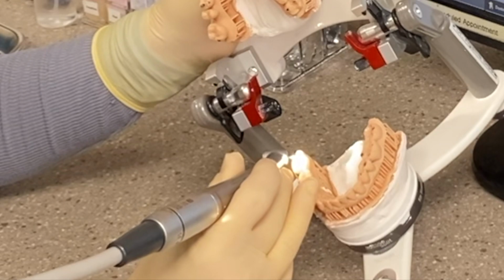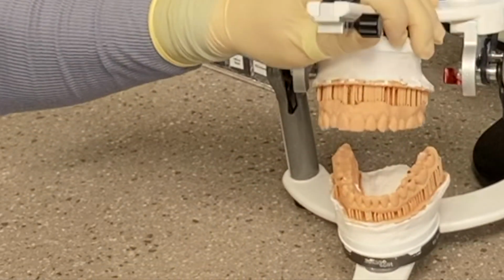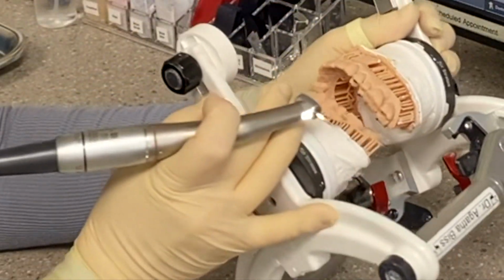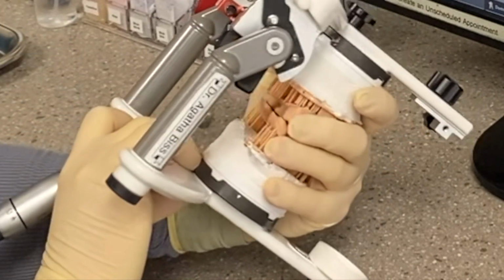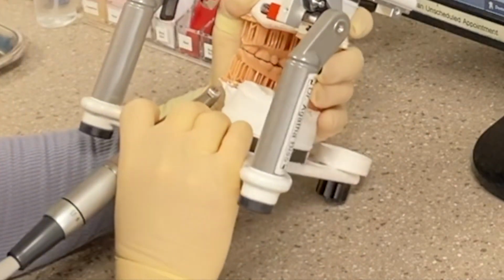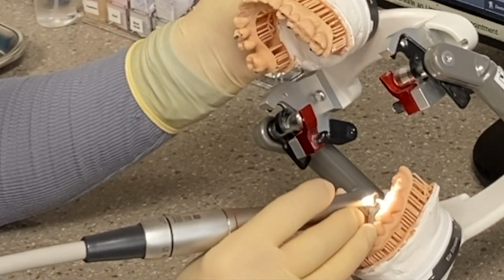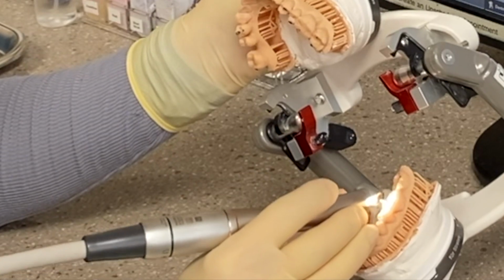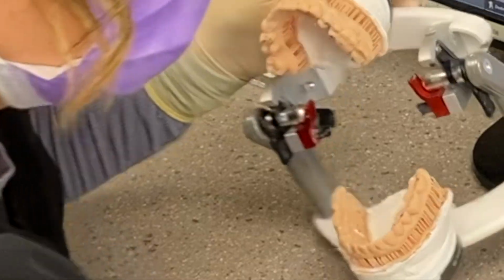In this case, it was hitting the incline of the lower, and then let's see what's going on the top. This is again the cool thing, you can turn it around and see it from inside. So the upper cusp is hitting the incline. Again, I'm going to take down the incline. And we'll T-scan again.